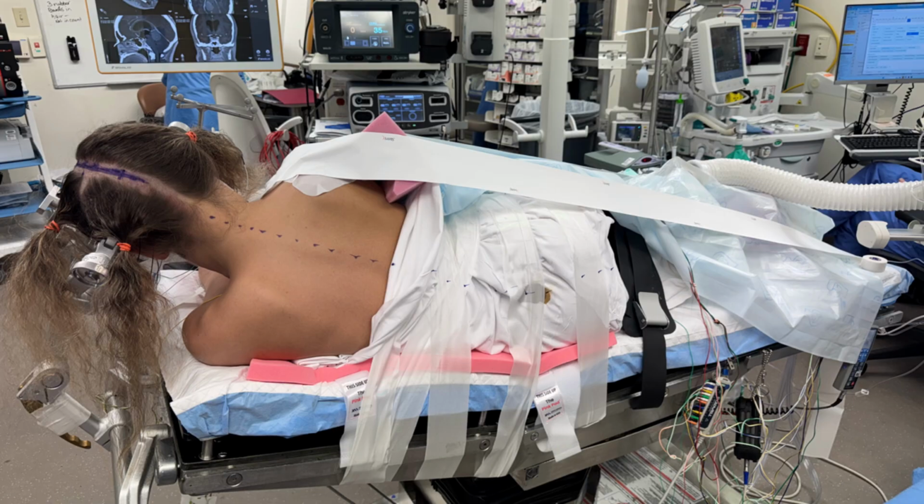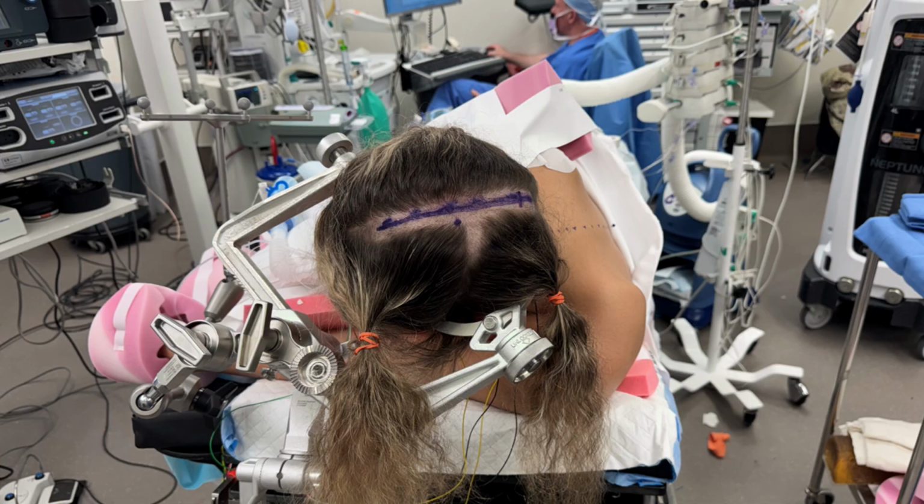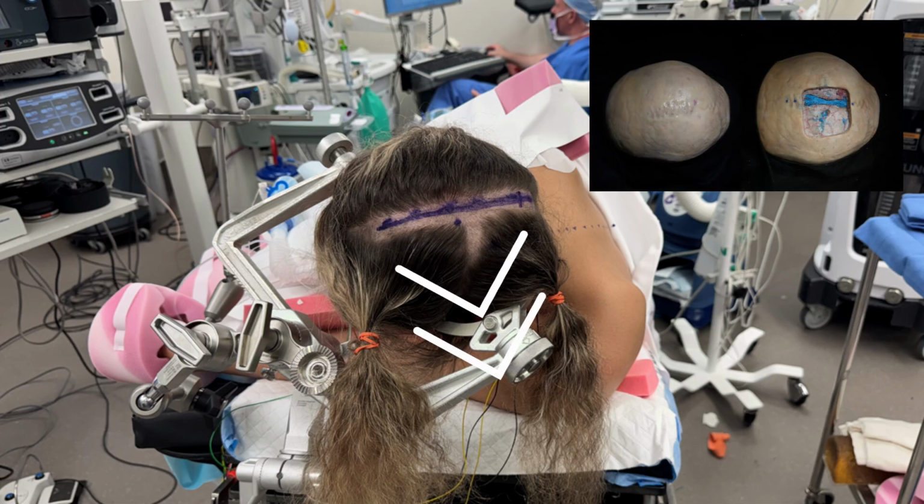Then the patient is positioned in park bench. The head is tilted 45 degrees with the floor to maximize the working corridor while sitting, with gravity aiding a clean surgical field.